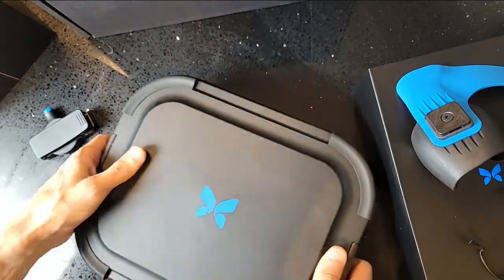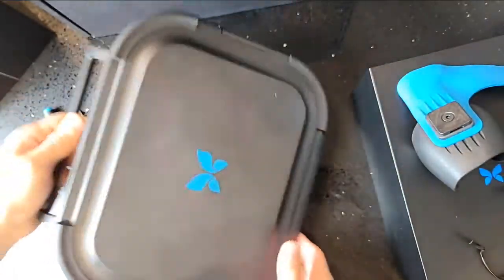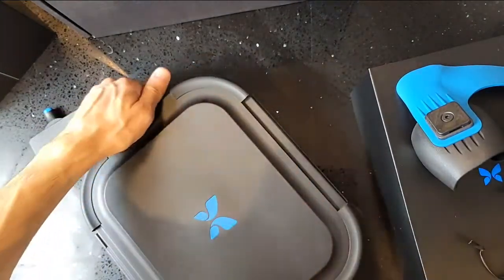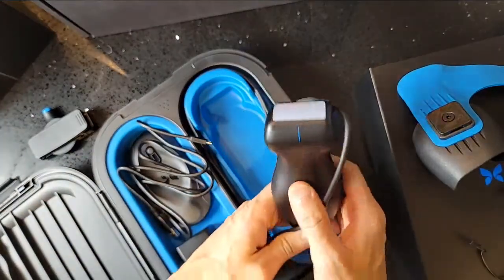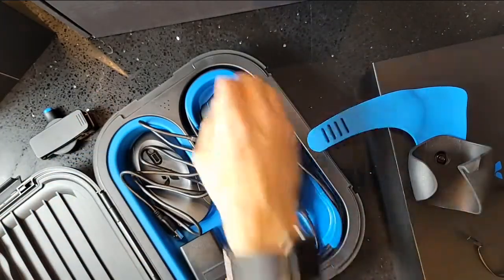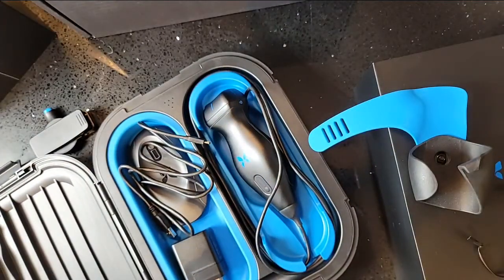The case will close firmly and it's ready to carry — that's the Butterfly IQ Plus portable ultrasound probe, newly designed by the Butterfly Network. The probe retails for about $1,999, the holster for about $49.99, and the hard carrying case for about $199.99. Overall I'm pretty happy with it so far — time to actually play with it. Thank you all for tuning in.